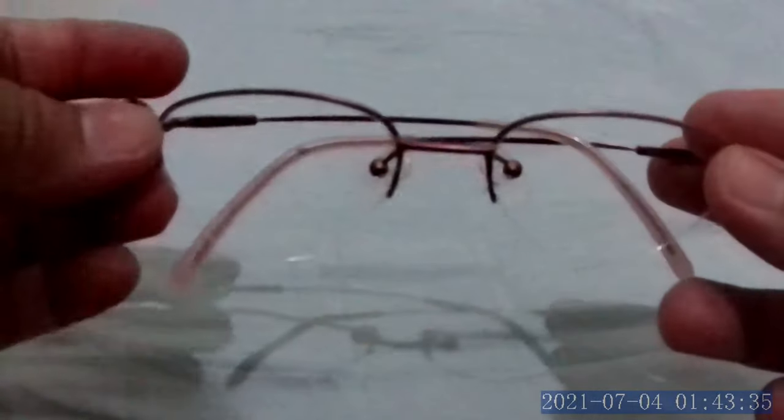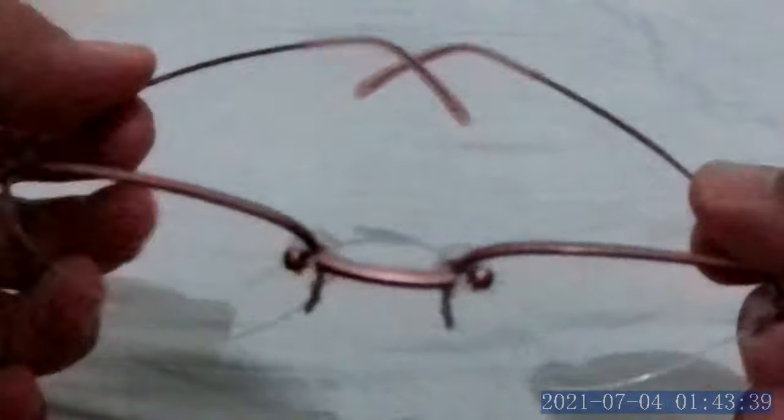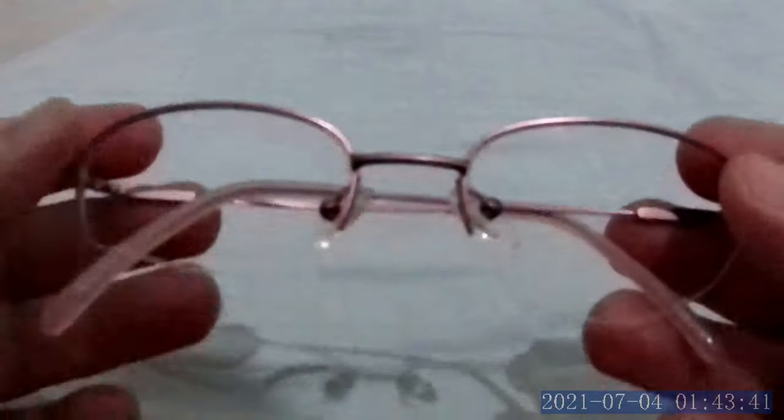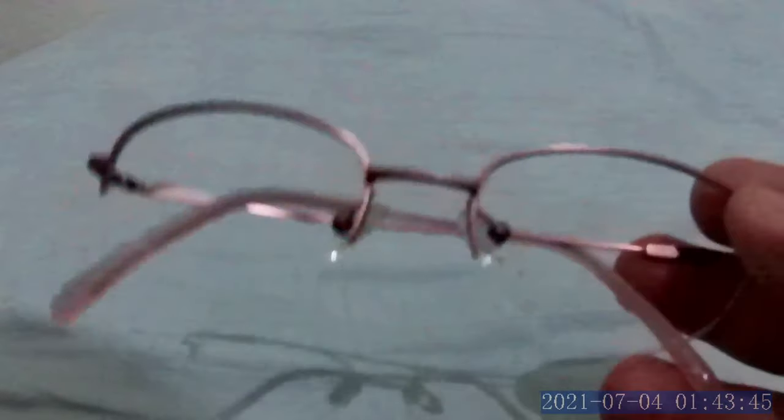So those are the two ways to remove the lens. Now if you have a broken frame, you can buy just a frame — the same frame — online or at a local optical shop in your area.